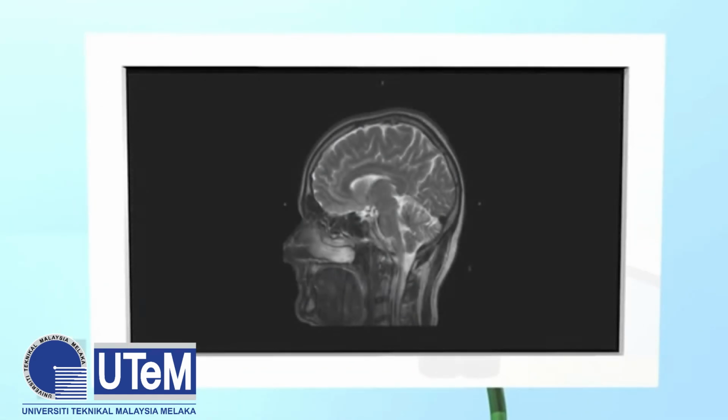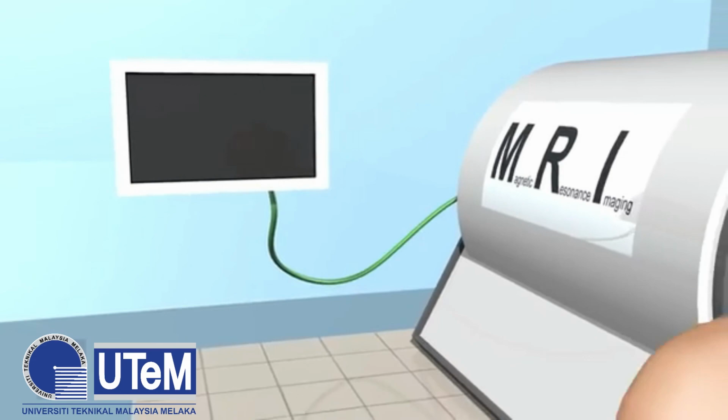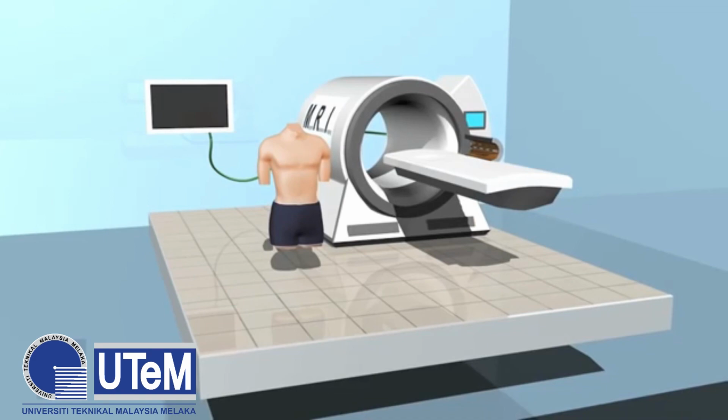joints, and other parts of the body in order to highlight abnormalities such as herniated vertebral discs, cancer, stroke, broken ligaments, and aneurysms. The radiologist uses multiple RF pulses at different powers and in different sequences to manipulate the signal from those parts of the body.